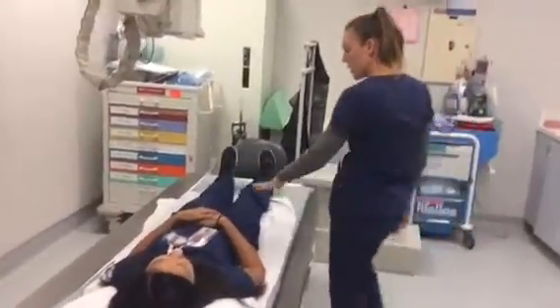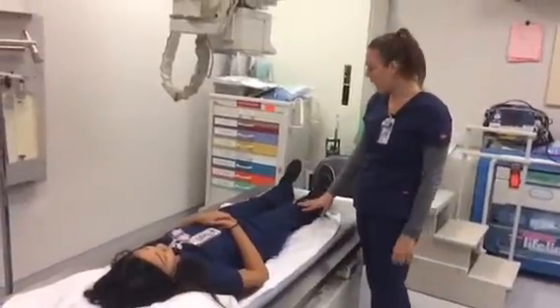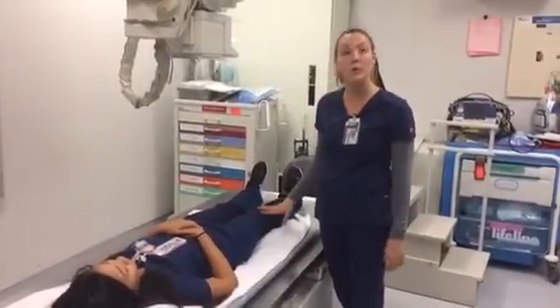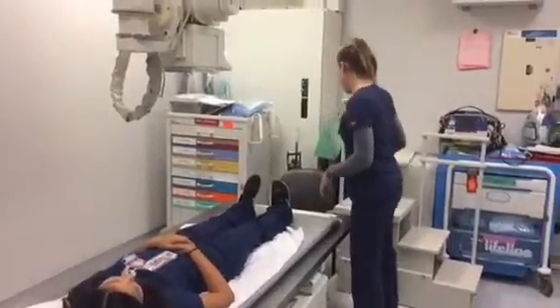Okay. So it seems that these pants are okay for the X-ray. However, if this was a real patient, I would probably move the pant leg up to expose the knee.